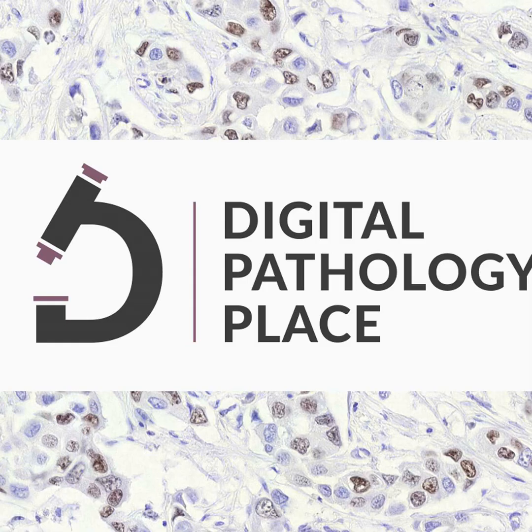We try to apply the latest computer vision approaches, which in the end is deep learning, often also referred to as AI, to first get a very accurate segmentation, and then also with an independent deep learning model or classification approach to classify the positivity for the different markers. For one data set, we often work with 8 plexes, because that's a sweet spot between dimensionality and channels, but also how to handle and how quickly to analyze.